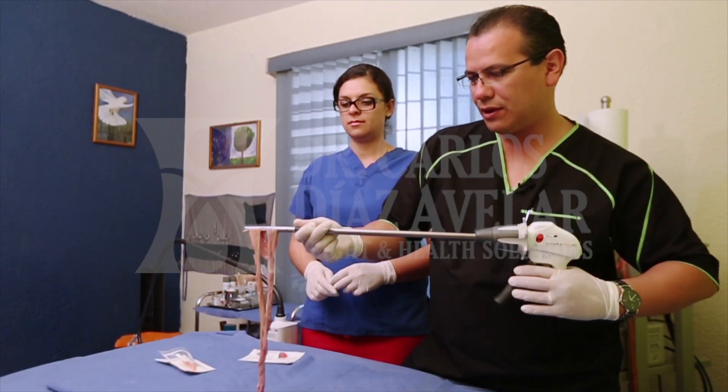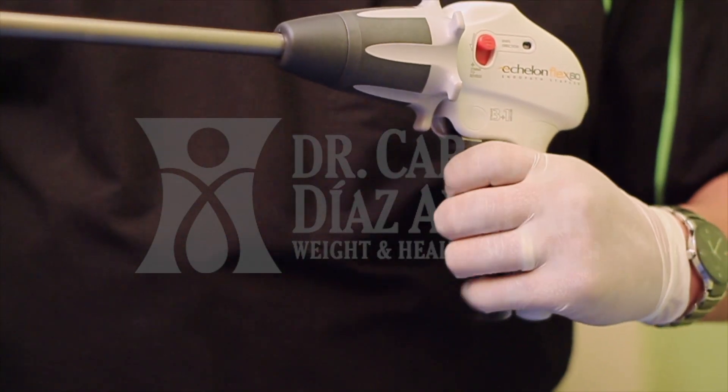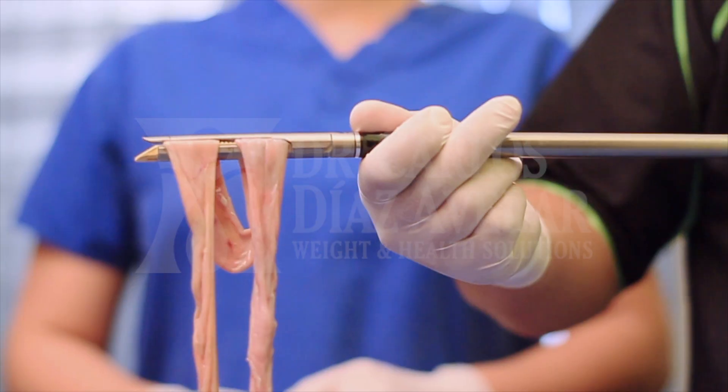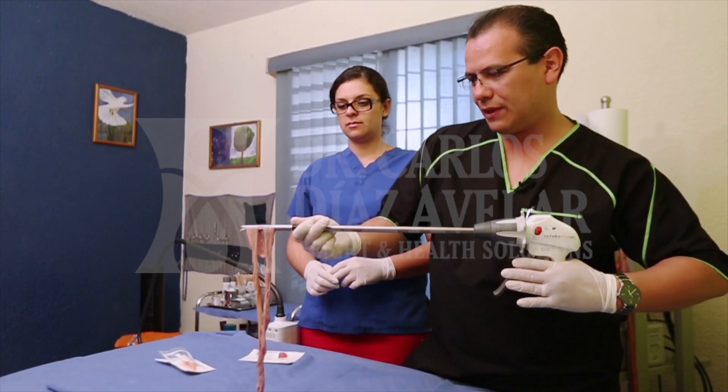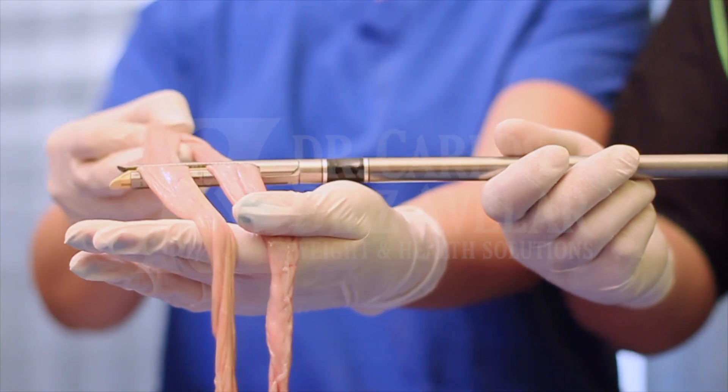This is the first click, this is the second one, and this is the third one. And finally, the fourth action is going to be the cut. And that is all.